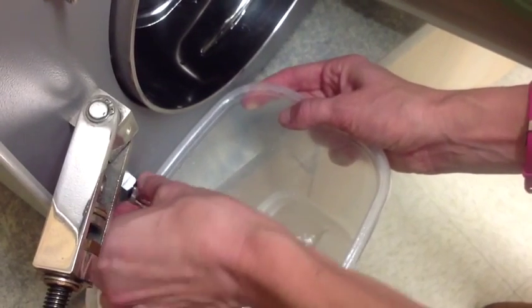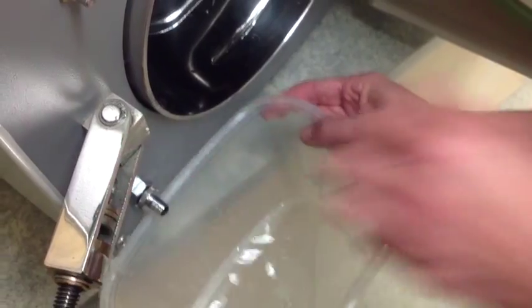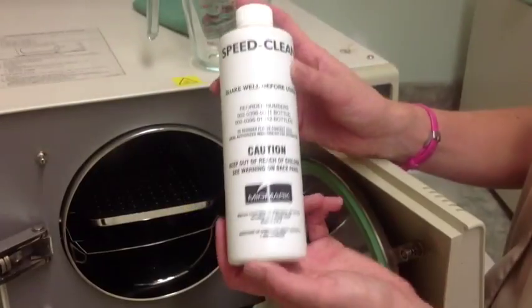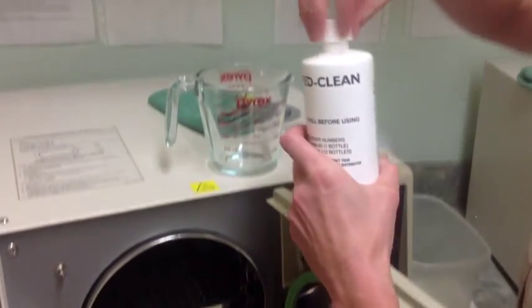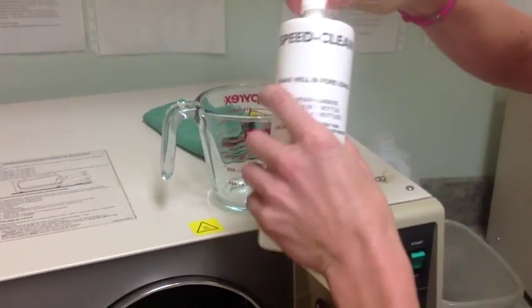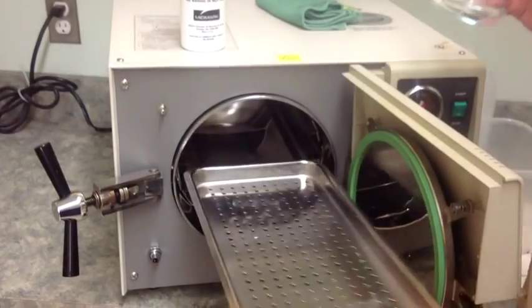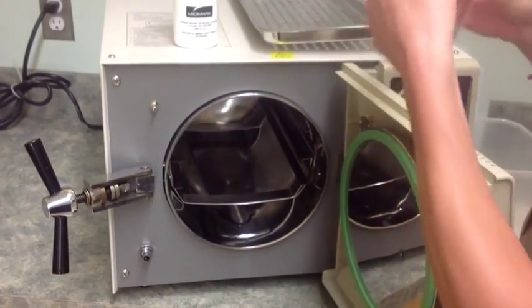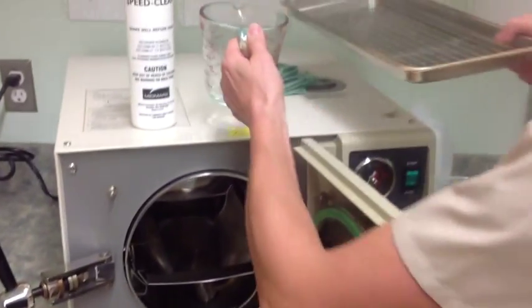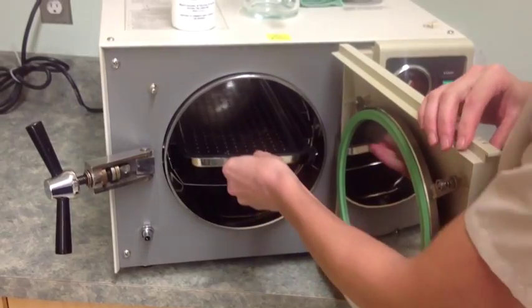We will now demonstrate how to do a weekly cleaning of the autoclave. First, completely drain the reservoir and then refill it using 2 liters of clean distilled water. Add 30 ml of Speed Clean to a cool chamber. Run the empty autoclave for 6 minutes at 270 degrees Fahrenheit. Never run instruments in the autoclave while you are cleaning it.